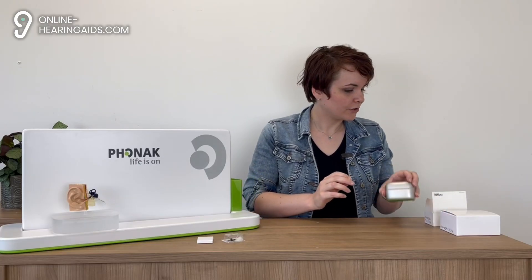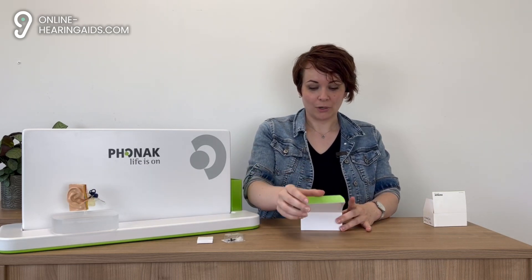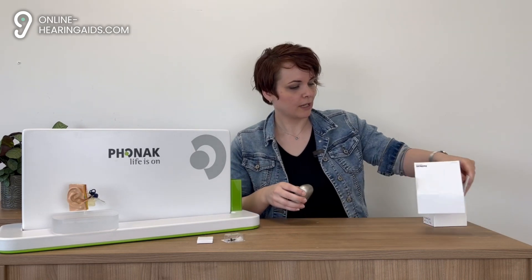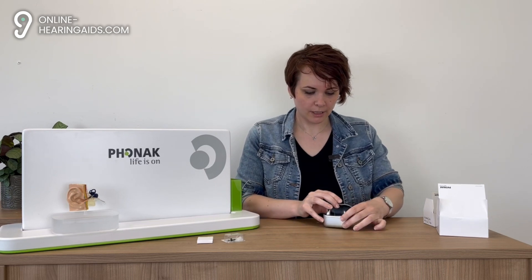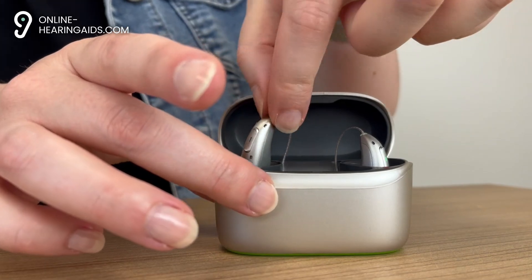Now let's move on to the Phonak Audeo Sphere Infineo R. This is the model for those who want the very best when it comes to speech understanding in challenging environments. They are equipped with two microchips: the DeepSonic chip, which uses artificial intelligence to automatically filter out background noise, and the Aura chip that also comes with the Infineo. The result is a hearing aid that automatically adapts to the environment you're currently in.